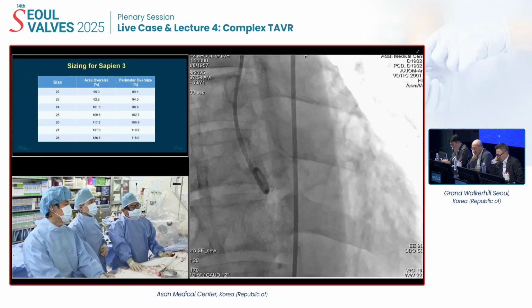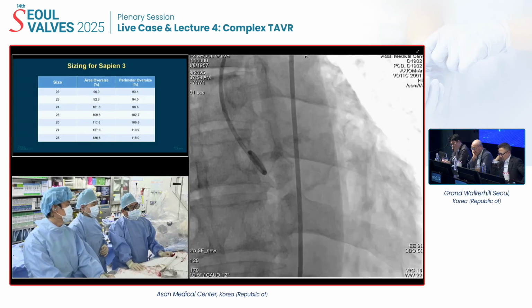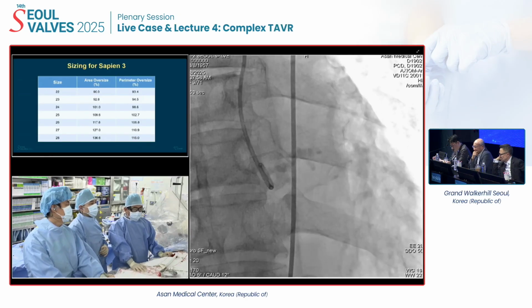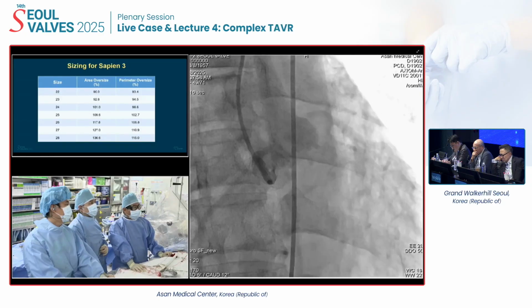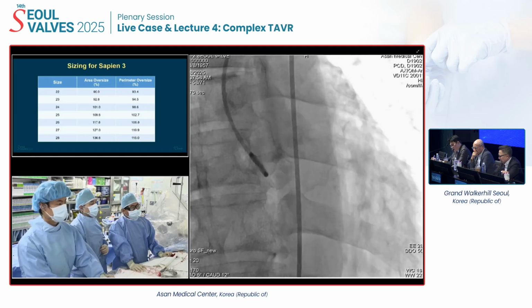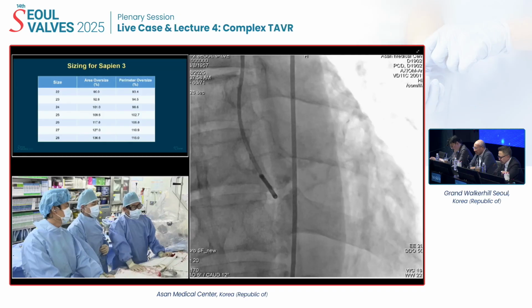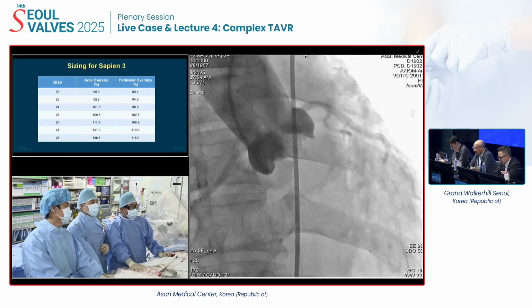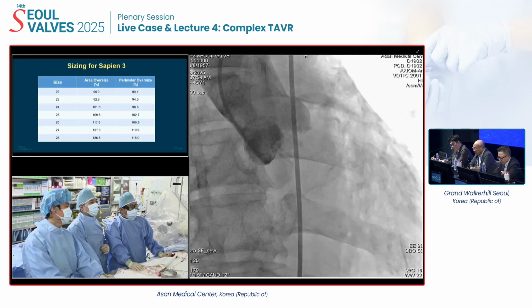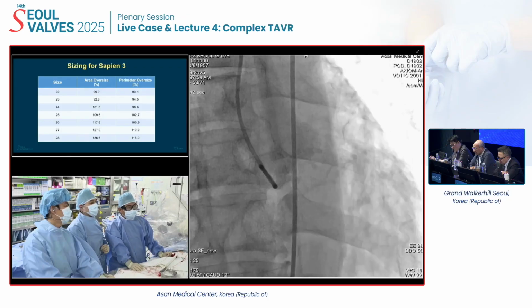In a 68-year-old, the incidence of bicuspid among the severe AS population is naturally more than 50%. Of bicuspid aortic valve patients, 50% underwent surgical or transcatheter aortic valve replacement. So if we want to do TAVR in younger patients, we have to know how to deal with the bicuspid aortic valve, particularly the very calcified bicuspid aortic valve disease. This patient's aortic valve calcification is more than 1,000, so we consider it very significant calcification.